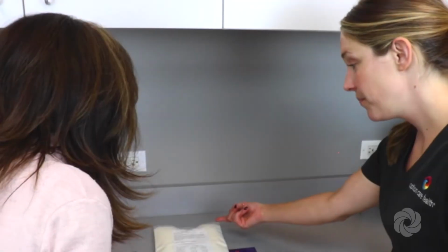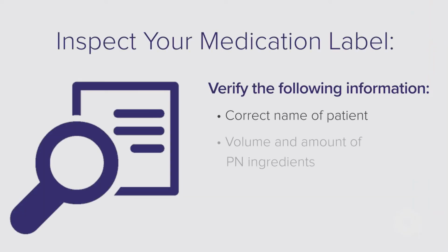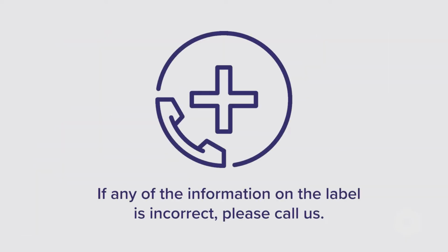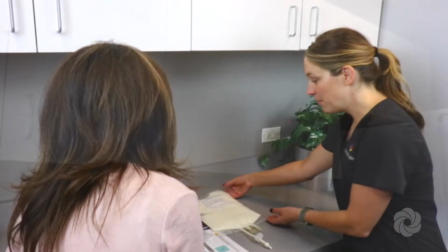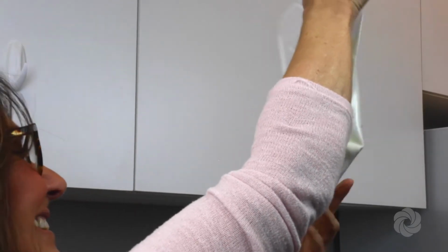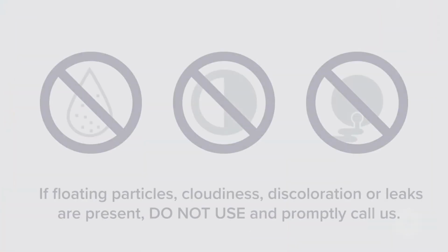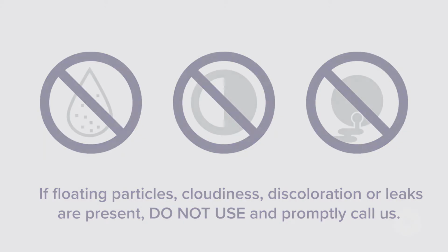Carefully read the PN label and verify the correct name of patient, volume, and amount of PN ingredients and expiration date. If any of the information on the label is incorrect, please call us. Carefully inspect the PN bag for floating particles, cloudiness, discoloration, or leaks. If any of those are present, do not use and promptly call us.